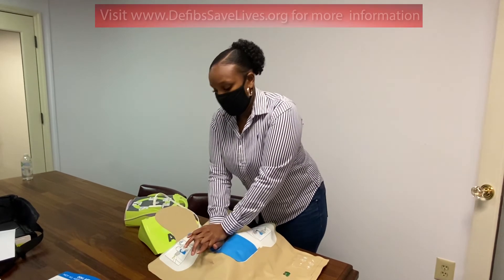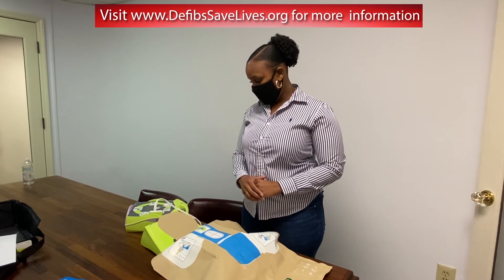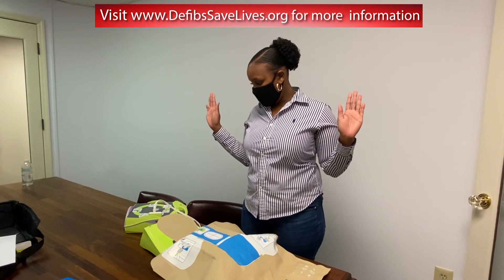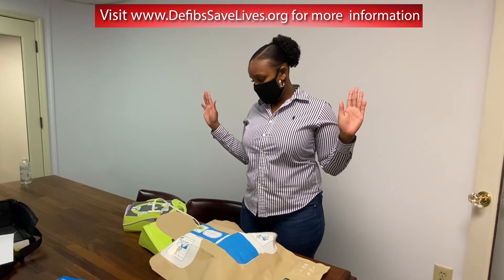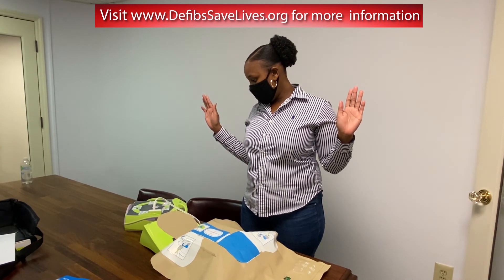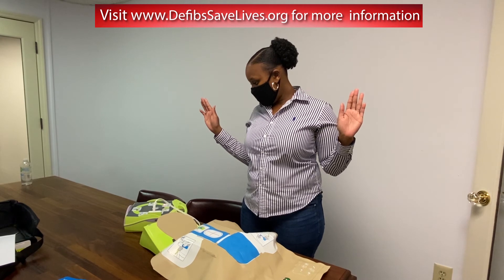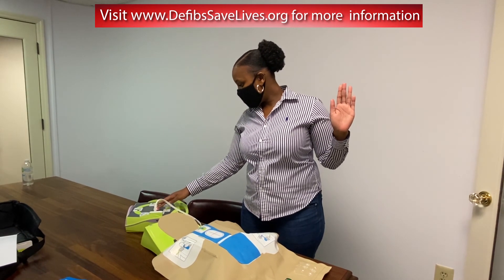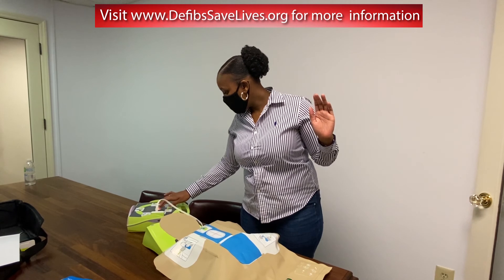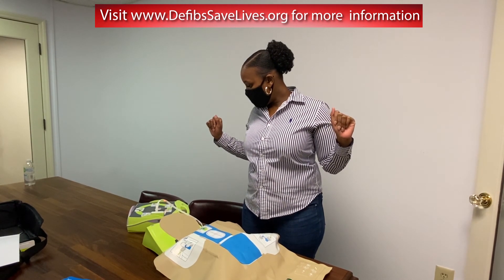Stop CPR. Don't touch patient — analyzing. Don't touch patient — analyzing. Shock advised. Don't touch patient — press flashing shock button. Shock delivered. Start CPR.